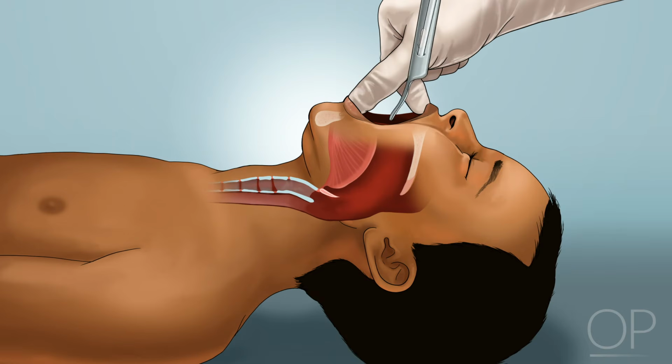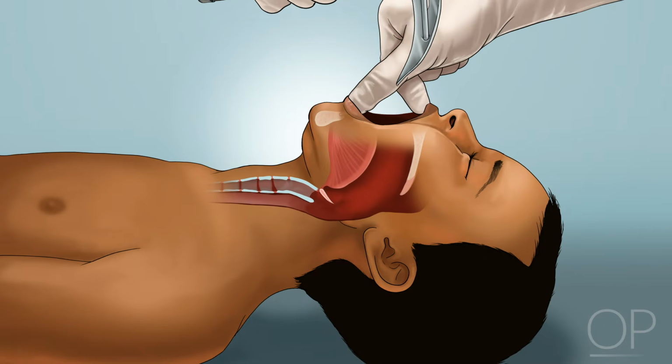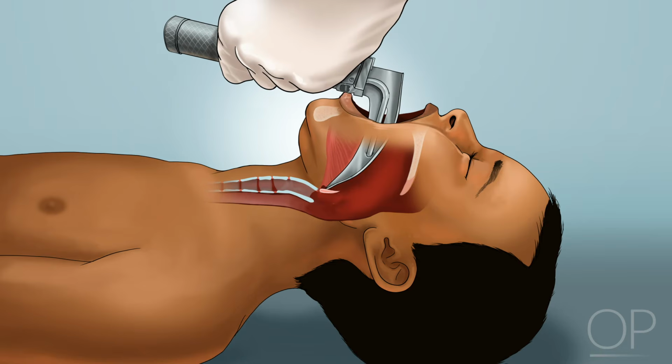Different techniques may be used with different laryngoscope blade types. The first option is to use a straight or Miller laryngoscope blade placed directly under the tip of the epiglottis and gently lift to compress the epiglottis against the base of the tongue to provide visualization of the glottic opening. The second technique is to advance the tip of the curved, for example, Macintosh blade, until it lies in the vallecula, just below the base of the tongue. The entire laryngoscope is then lifted in the direction of the handle to visualize the glottic opening.